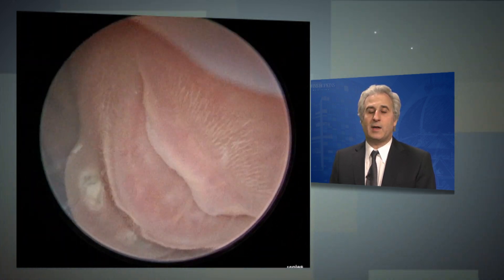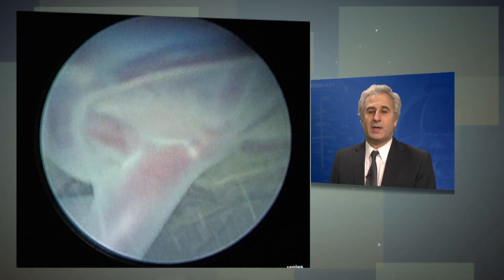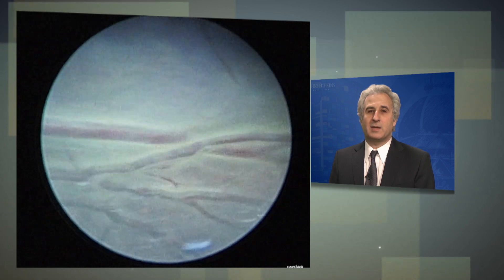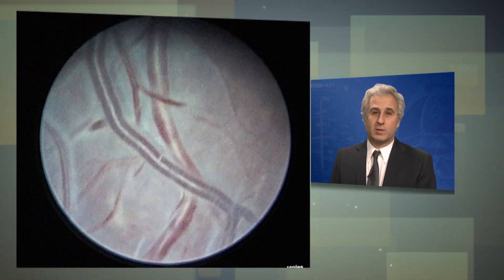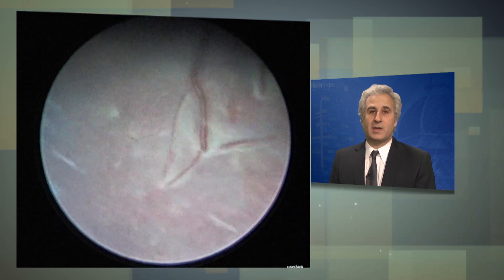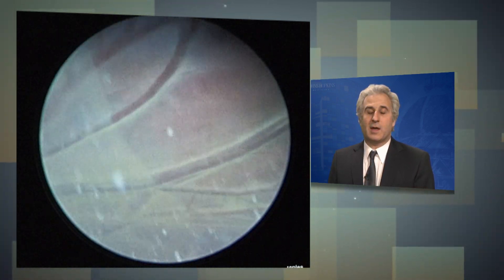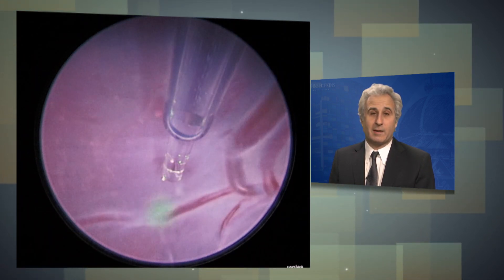we will identify the cord insertion of the recipient, as you see here in the middle of the picture, and from there we will follow the vessels that run on the placenta and selectively identify those that connect with the donor twin. The white line that now comes into the image is the membrane in the donor twin that's draped over the placenta, because that baby has no fluid left.